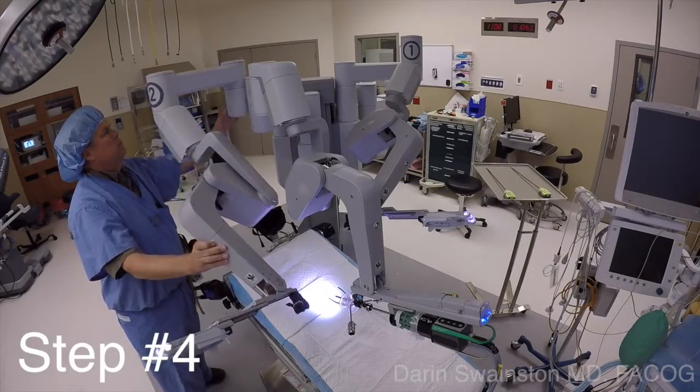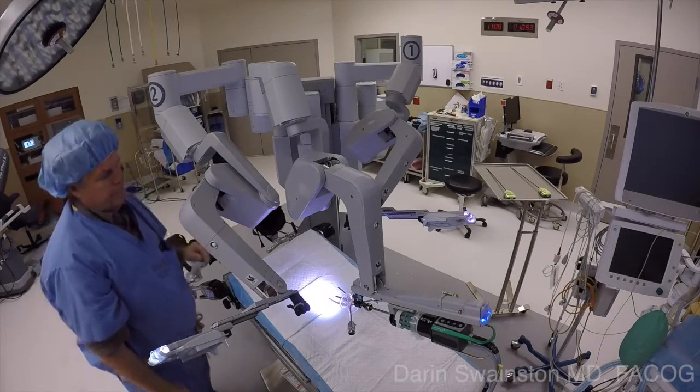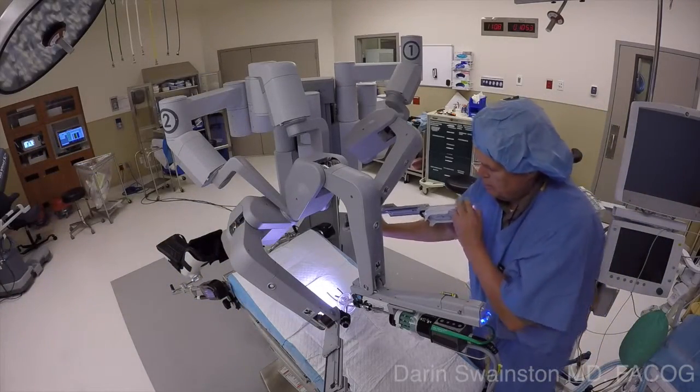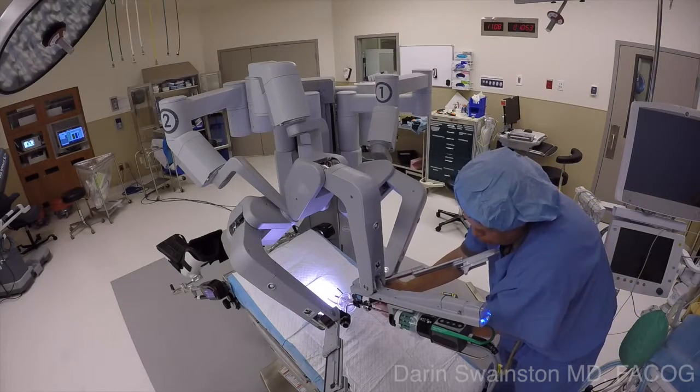Step number four: Frankenstein that arm so that you have plenty of room to dock on the side without a lot of collisions. Then go ahead and dock arm number one when you're done.